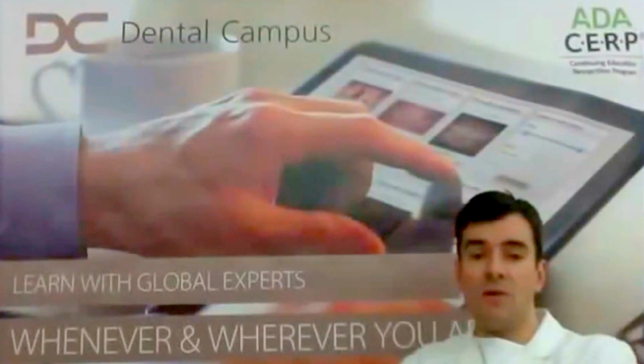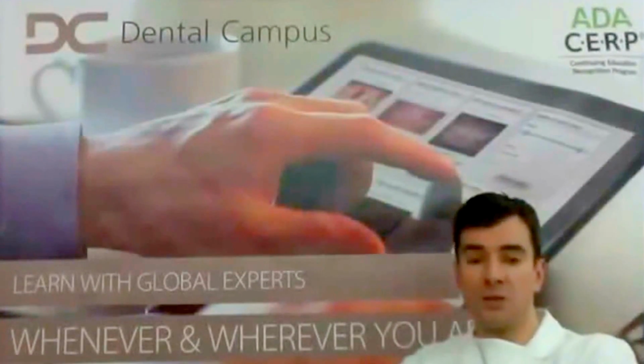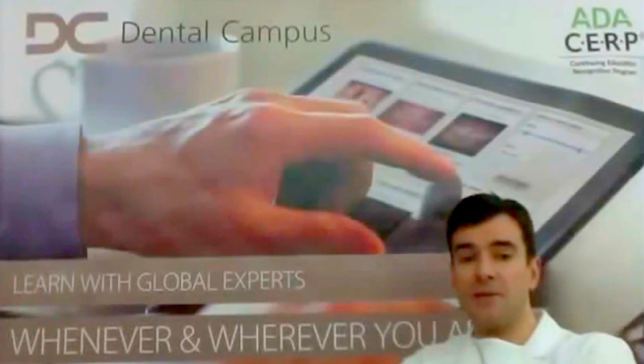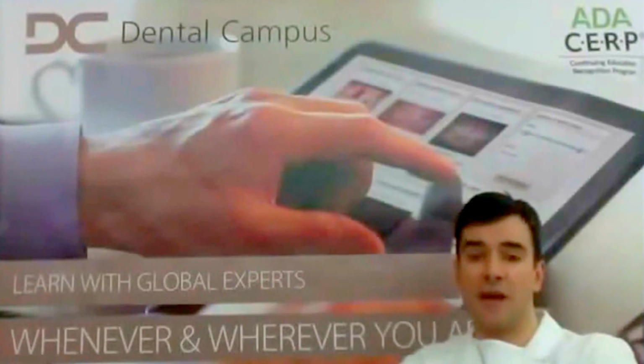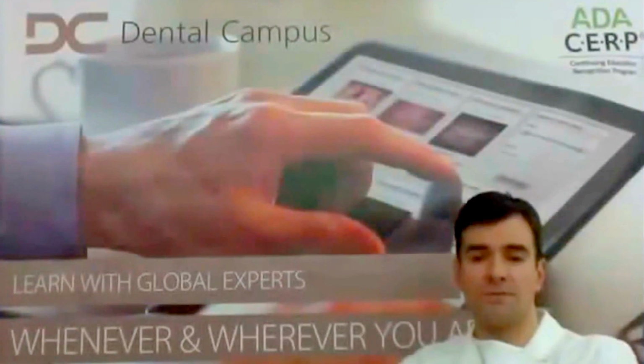So if there are 3 to 4 millimeters of bone in the apical coronal dimension, I'm going to inform the patient in advance that the chance of being able to perform the implant placement simultaneously to sinus floor elevation is very high. However, there is never 100%. So again, it's like 3 to 4 millimeters. If you have less than that, then I inform the patient that probably you're going to use a staged procedure.